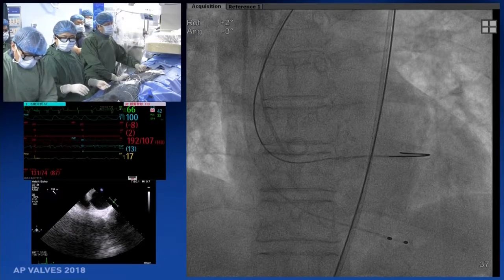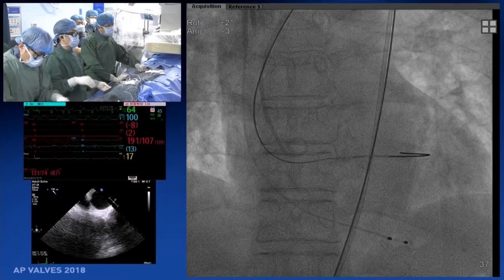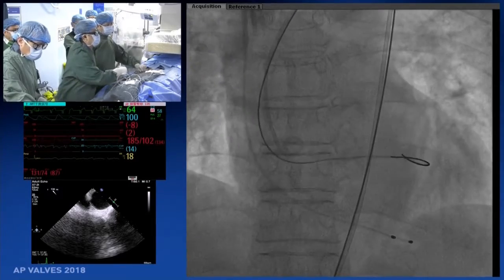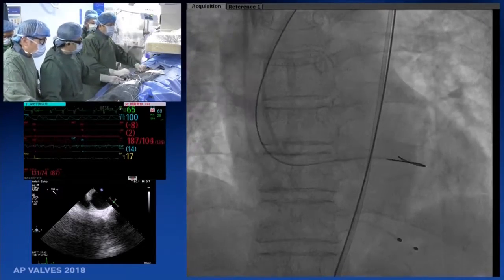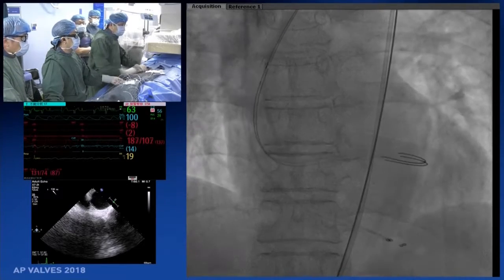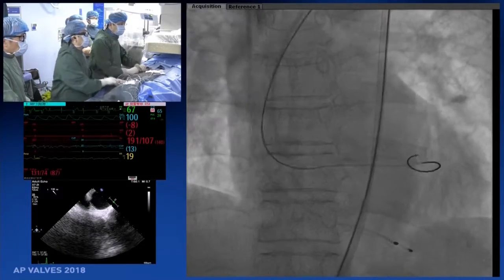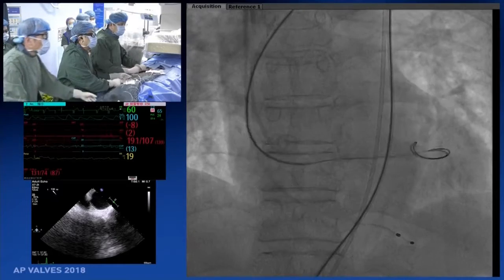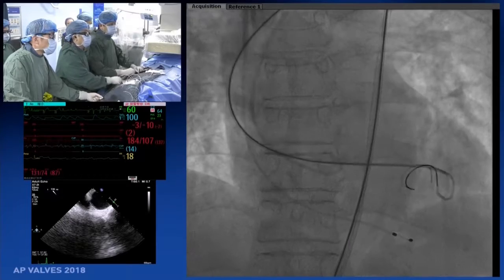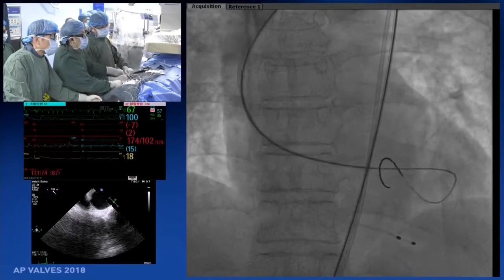recapturable? So now, can you see that the chamber of the left ventricle is too small? So we push the wire, and we can see that the part of the wire in the left ventricle is short and is changing. So we are going to replace the wire. We try to get the pigtail in, then we need to change the wire position. Good. Well, that's better. Much better. It will stay there. I think it's okay.